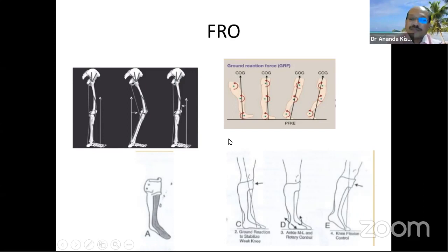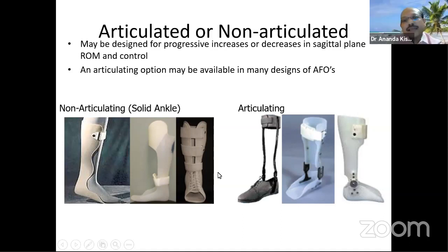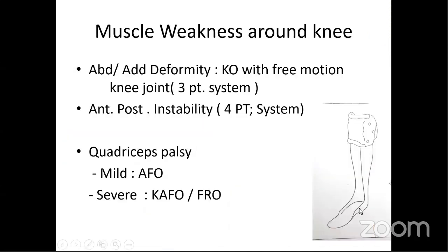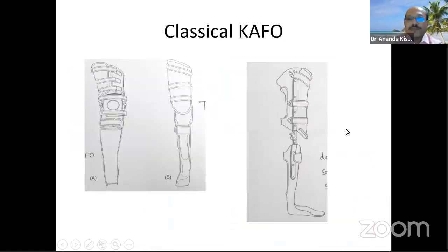So how is it different? See, this is the classical modern variety of ankle foot orthosis, where the foot and the leg piece are kept at 90 degrees. That is not plantar flexed. But here there are two differences. The first difference is this junction of the foot plate and the leg plate. It is attached at 15 degree plantar flexion, and there is an anterior leg bar.